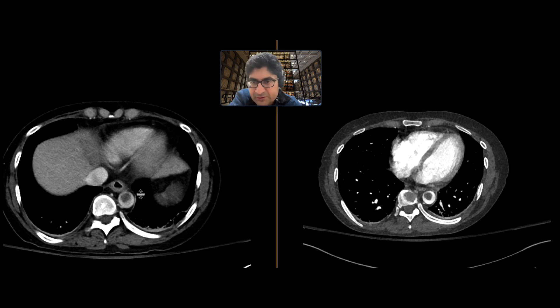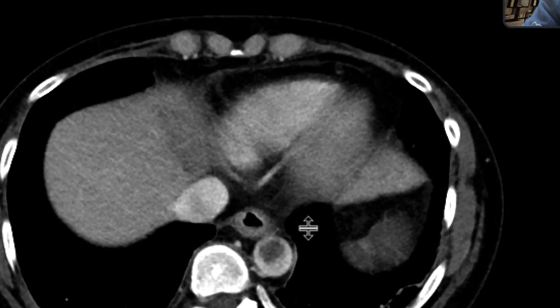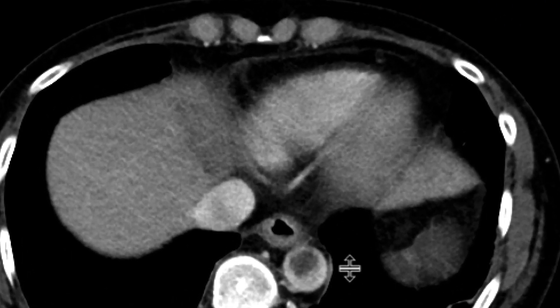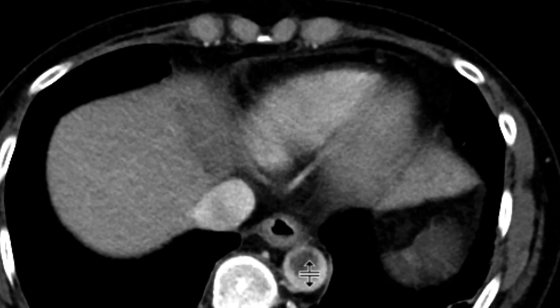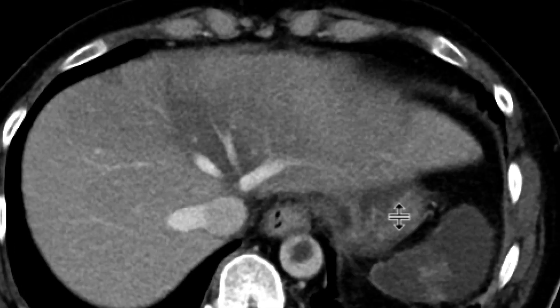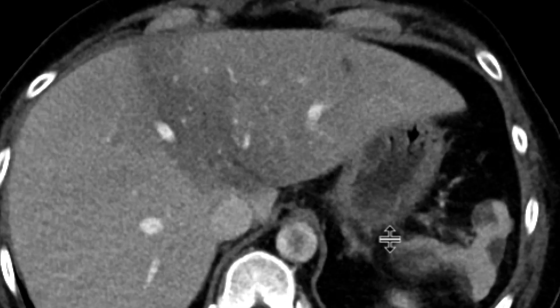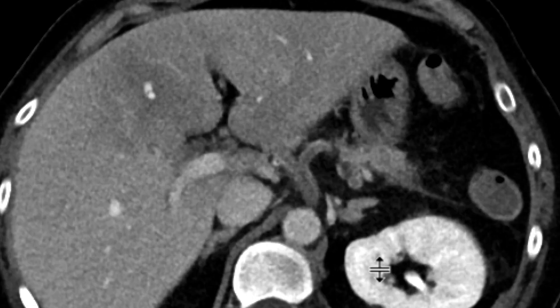Starting with the portal venous phase, as we scroll down we can already see at the lung bases, and right here in the distal descending aorta, this filling defect — this big thrombus that's almost floating in that aorta.